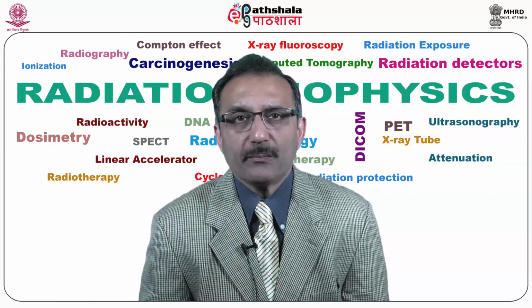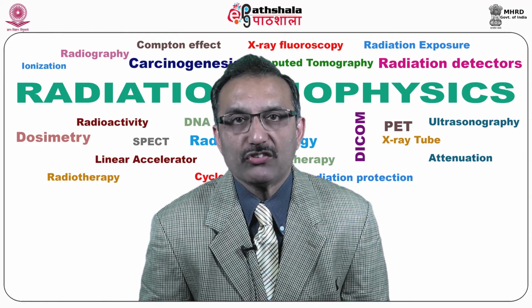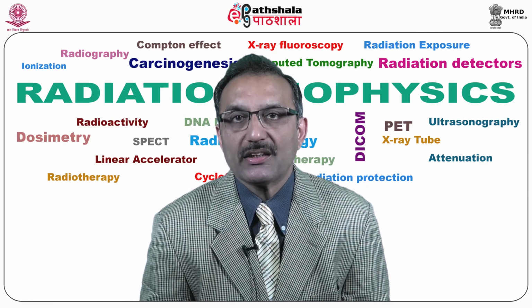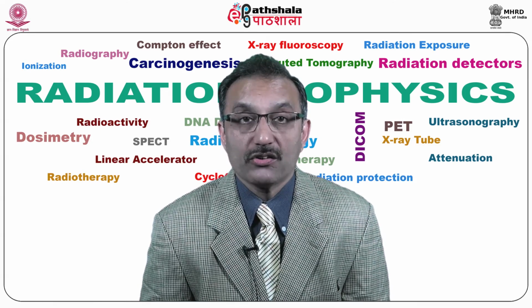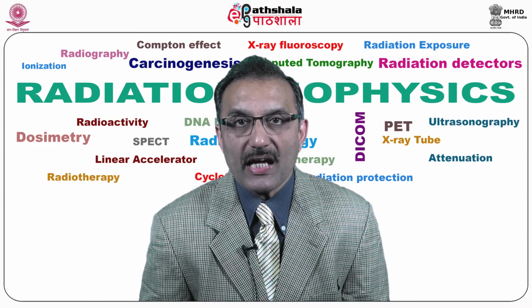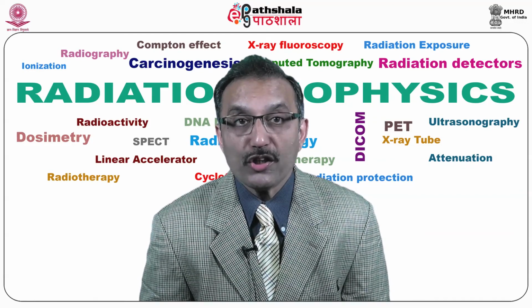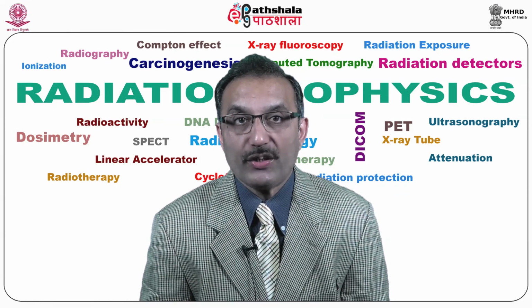PET can give false results if the patient's chemical levels are not normal. Specifically, test results of diabetic patients or patients who have eaten within a few hours prior to the examination can be adversely affected because of blood sugar or blood insulin levels. This is one of the limitations of PET scan. Also, because the radioactive substance decays quickly and is effective for a short period of time, it must be produced in the laboratory near the PET scanner. It is important to be on time for the appointment and to receive the radioactive substance at the scheduled time.